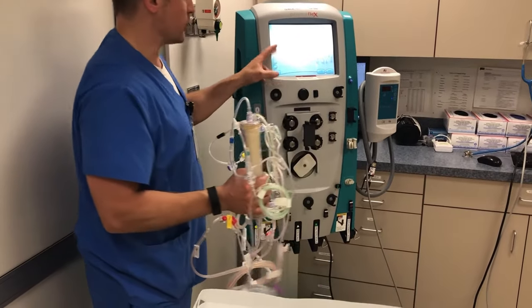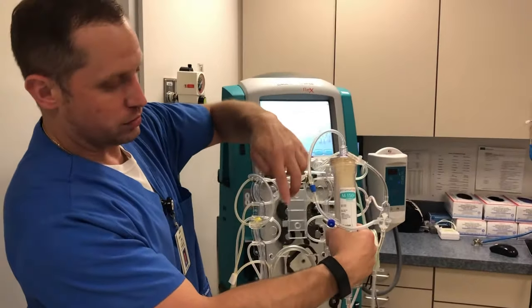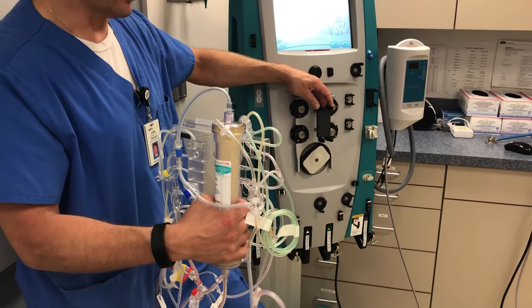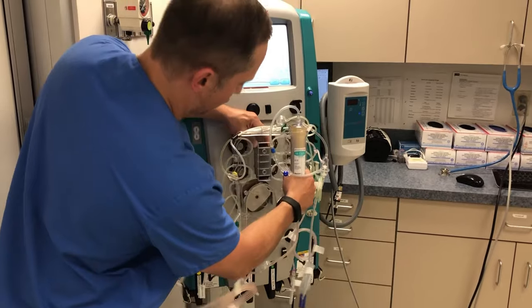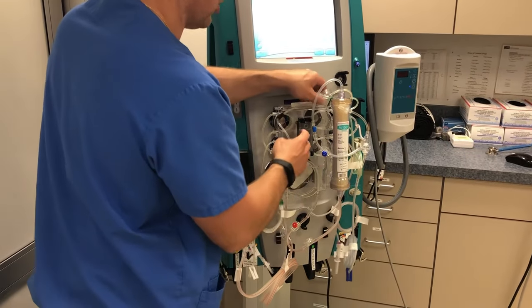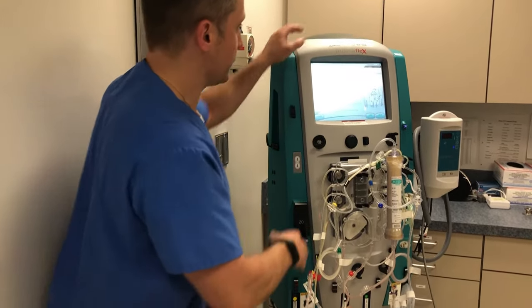So we're going to snap the cartridge into the carrier. As you can see, we have two holes here on the front of the cartridge, and we're going to squeeze these plastic black triangles together and close them together, and we're going to slide our cartridge onto that holder. Now, we don't want to push this section into the machine. We're going to wait and let the machine do that itself later.